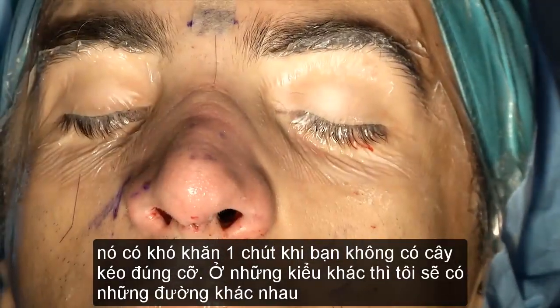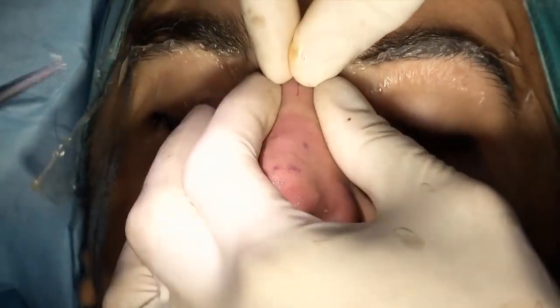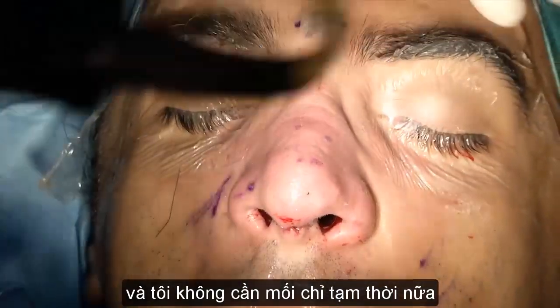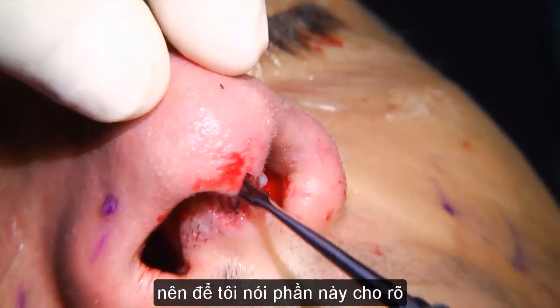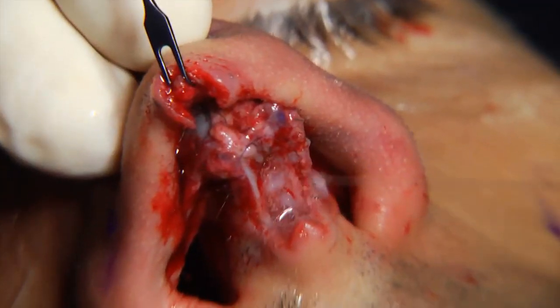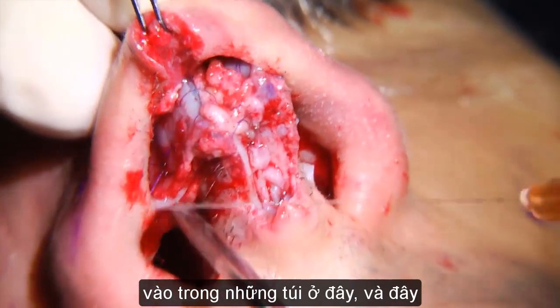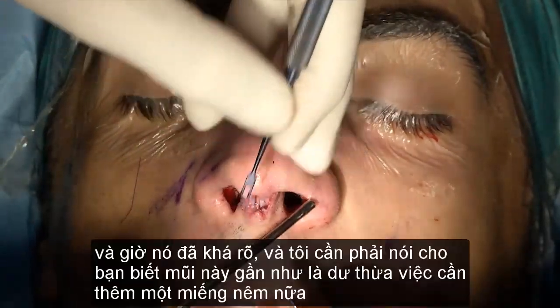It's a little bit tricky when you don't have the right scissors. In the other set I have a different pair. And I can say I don't need a temporary suture anymore. So let me get this clear. I took my time in putting these extended grafts in that pocket here and here. All right? So now it's pretty clear.